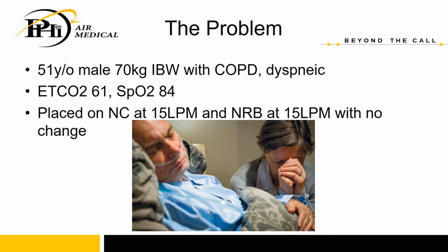We go ahead and replace that nasal end tidal with a real nasal cannula and place him on 15 liters per minute. Doesn't seem to be improving his oxygen saturation. He additionally gets a non-rebreather at 15 liters per minute, and there is no change.